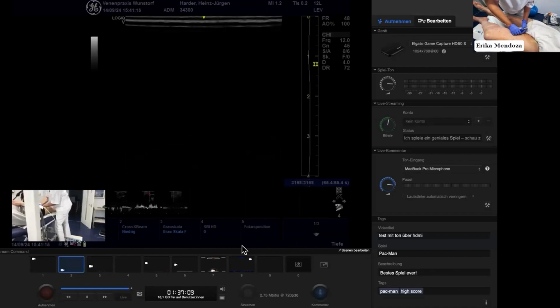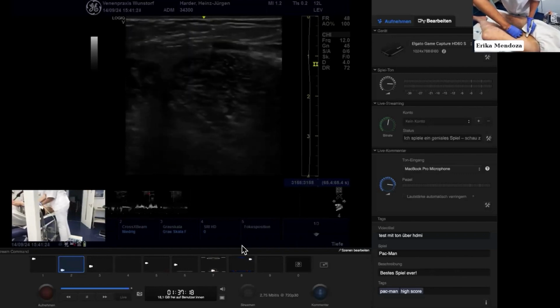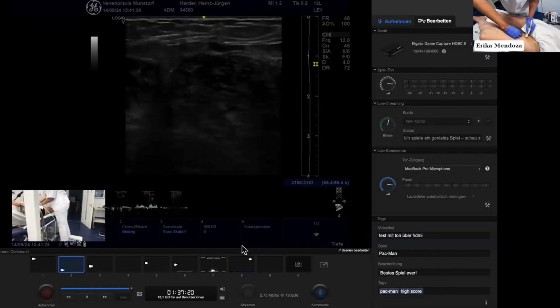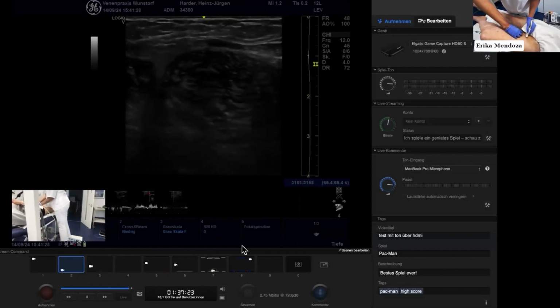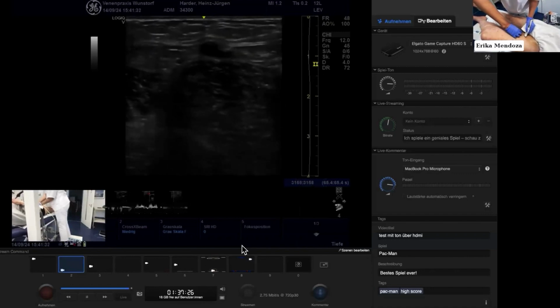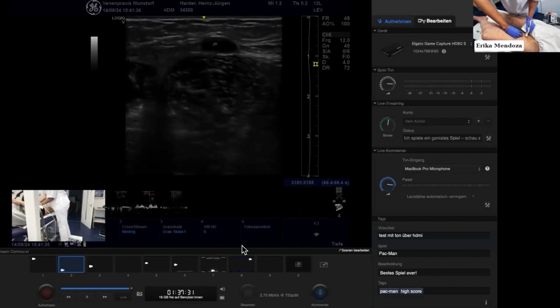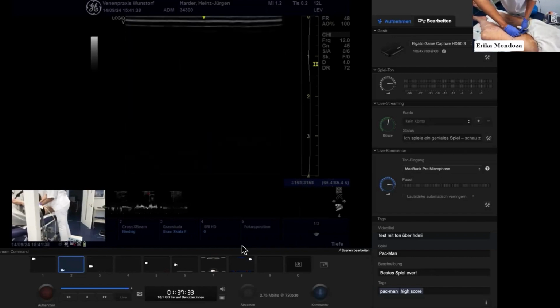Yeah, no, it's a very nice idea because you decrease the amount of lumen of the vessel and expose the intima, and you just fire the sclerotherapy to the intima. So surely it will get a powerful impact. It's a very nice idea. You've been using it for 20 years. Yes, sir. And what's more is that it reduces your demand for active dose of medication.